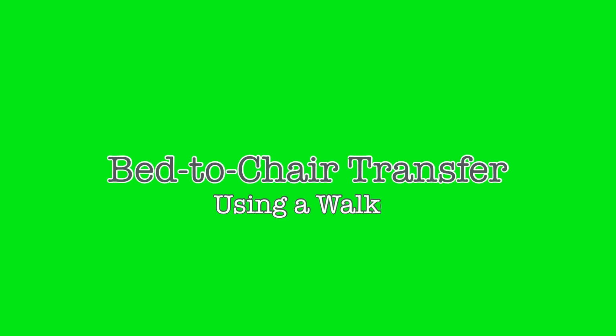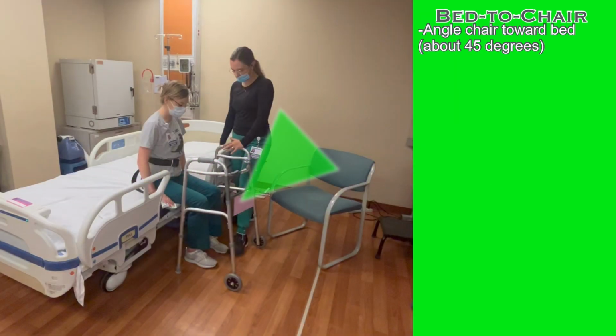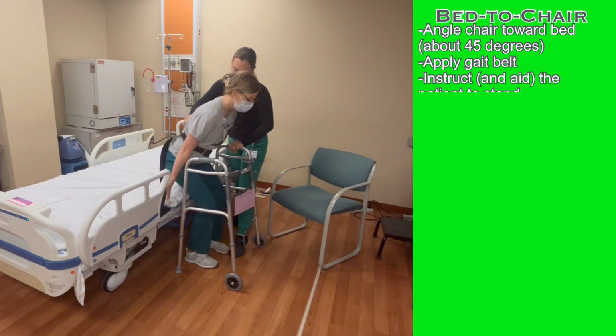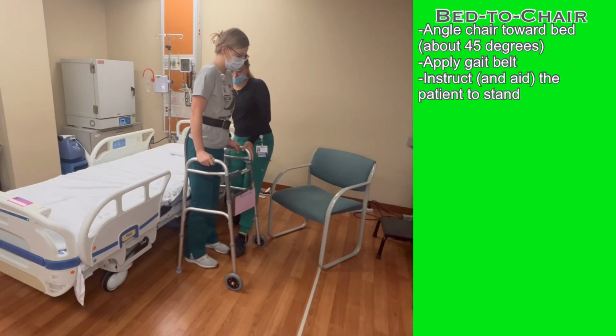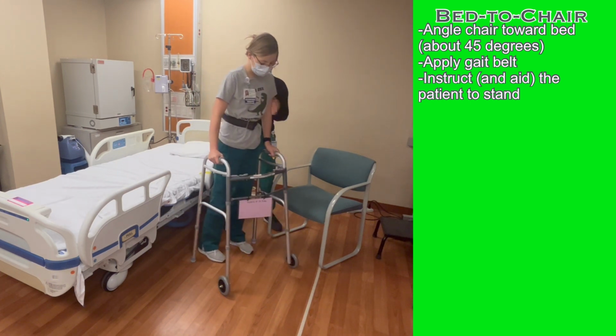To help the patient that requires minimum assistance safely transfer from the bed to the chair, follow these steps. Position the chair angled toward the bed, but far enough away to allow a walker to maneuver between the bed and the chair. Apply a gait belt to the patient and follow the process previously described to help the patient stand with a walker. The minimum assistance patient can do most of the work on their own. Your job is simply to guide and support.